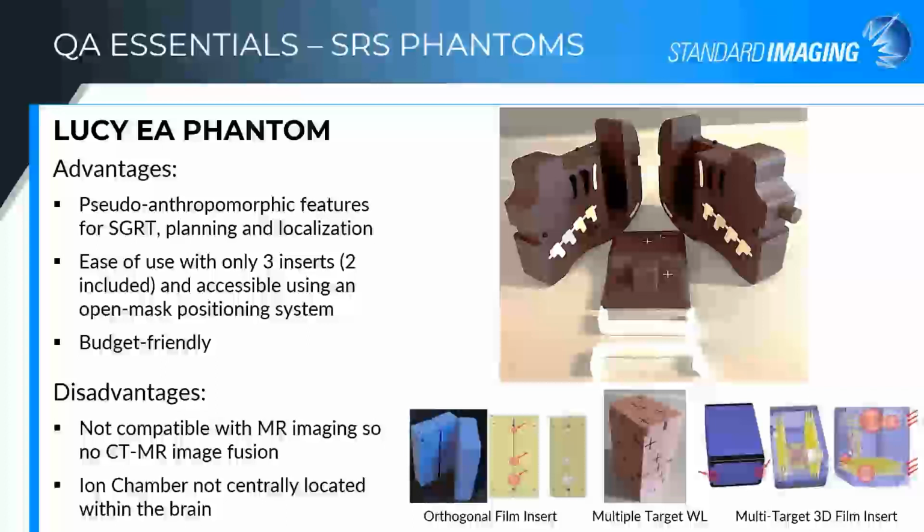So your MR inserts, do they line up? When you're doing your image fusion, do you see the 5 millimeter center fiducial to center fiducial on those? Those known distances and geometries are super important in that imaging and treatment flow. Yep, and matching the target on the CT with the target on the MR, that should be the same volume, should be the same size for the Phantom plan.